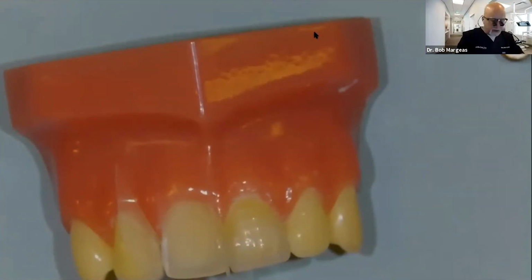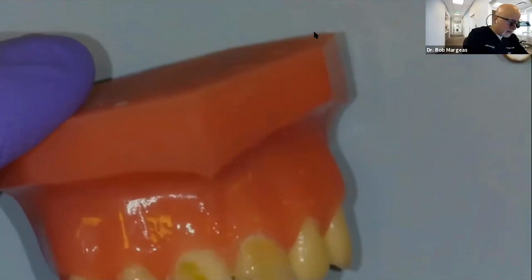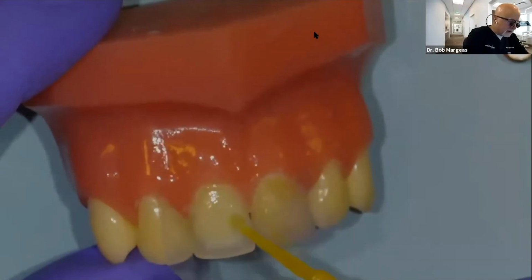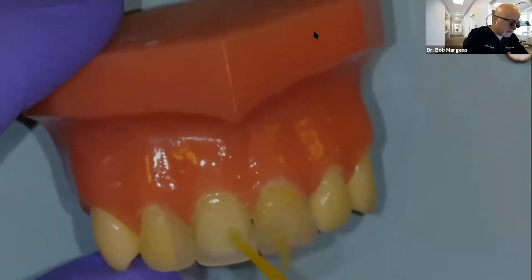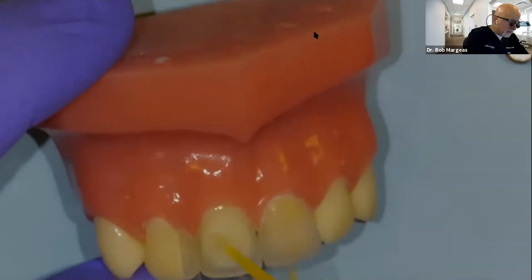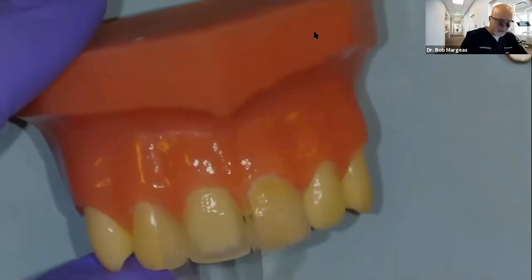So I'm going to put some on my micro brush. And I'm going to scrub the preparation as I would in my practice for 15 to 20 seconds. I want to scrub it for 15 to 20 seconds if I was doing this in my practice. And you want to make sure that you get a nice hybrid layer.